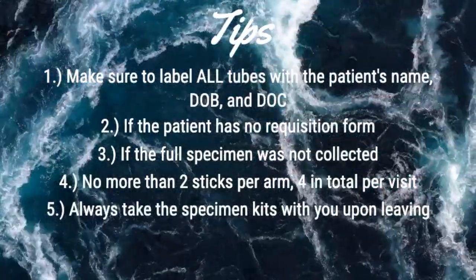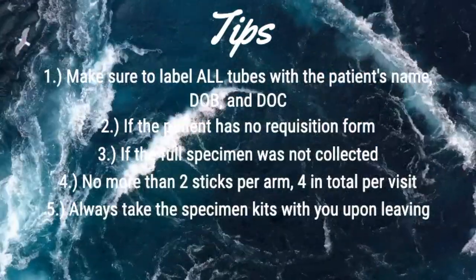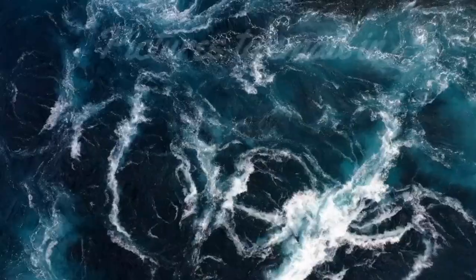Also, the kits cannot be left with the patient and always have to be mailed in after the seal is broken, no matter what. No kits should ever be left at the patient's home after the appointment.